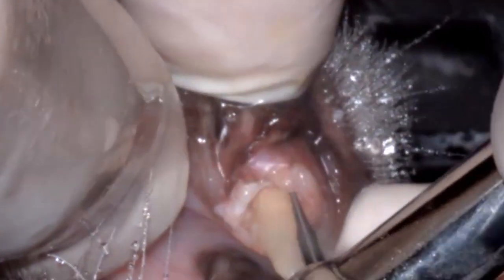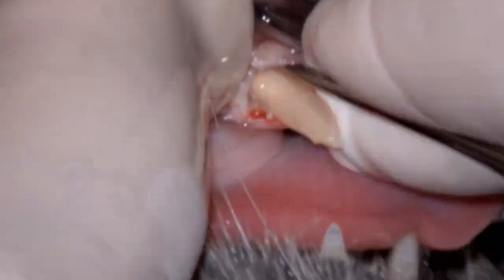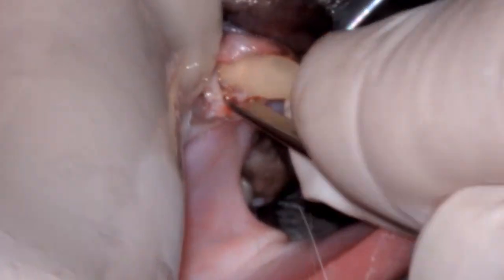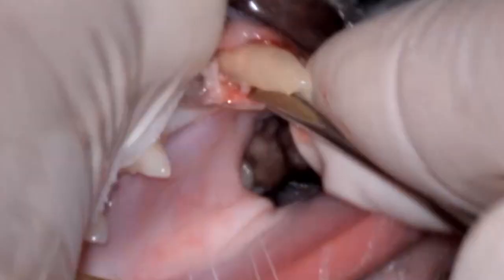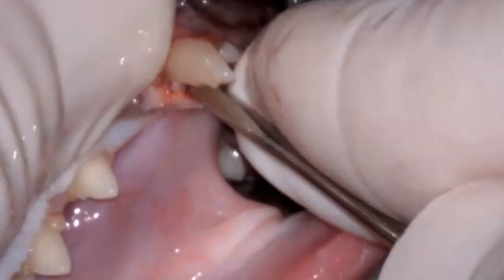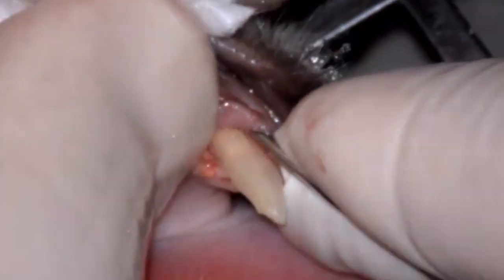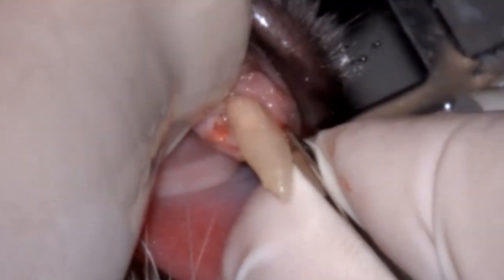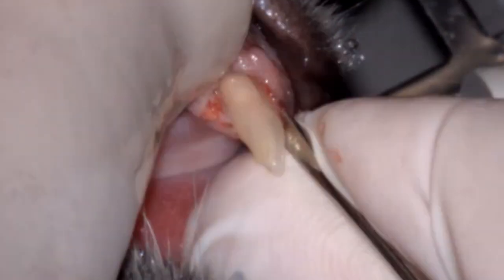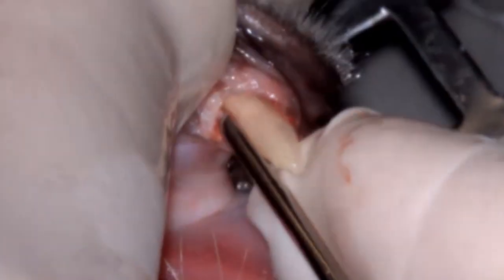I've selected an appropriately sized, shaped, and very sharp dental elevator and I'm going to start working on elevating this tooth out. Despite the radiographic signs, I'm still somewhat hopeful I might get this tooth out intact in one piece, so I'm working circumferentially around the tooth to start breaking down the periodontal ligament and loosening the root up.